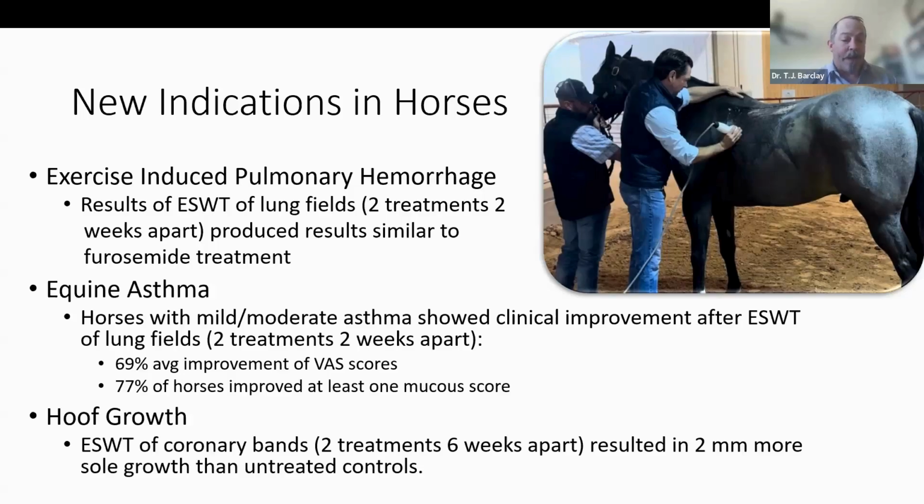And I'll note that historically, treating lungs or any air-filled viscus was listed as a contraindication for shockwave therapy. Since, due to the physics of sound waves, all that energy is deposited at the interface of air with the soft tissue, there was some concern that intense energy deposition at that interface might cause some tissue damage. Now, there were some anecdotal reports of treating EIPH in horses.